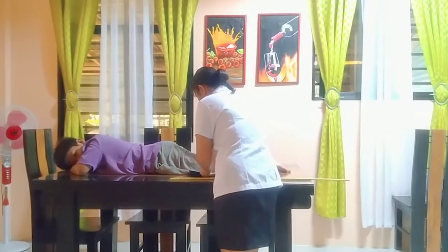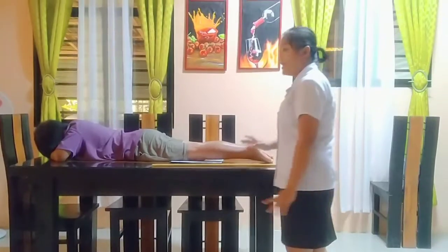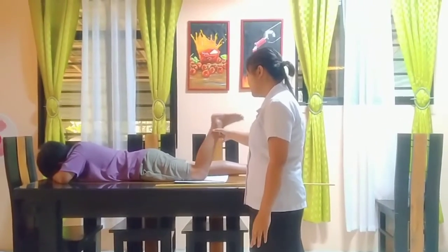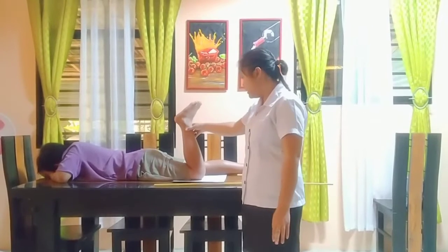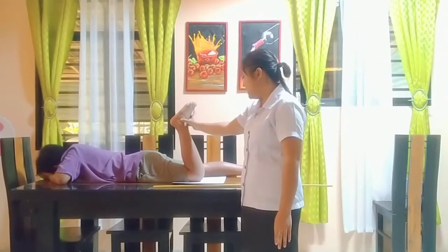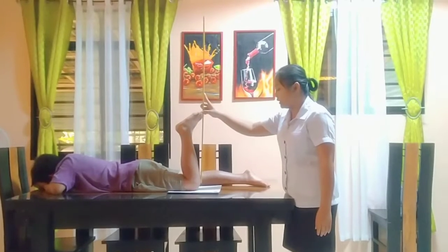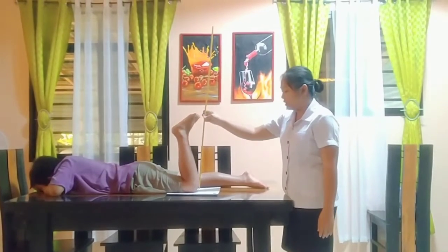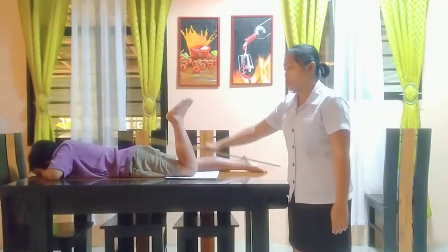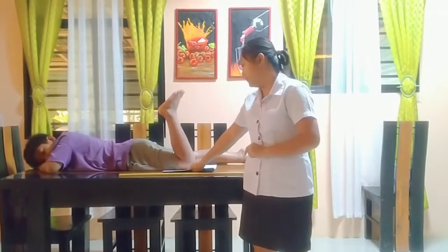Make sure that the knee is parallel to the IR. Flex the knee 90 degrees. So, nakaganyan po. Straight po. Straight. Ayan. 90 degrees. The central ray will be perpendicularly directed to the IR. So, inuulit ko po, this projection demonstrates a vertical fracture. Okay.